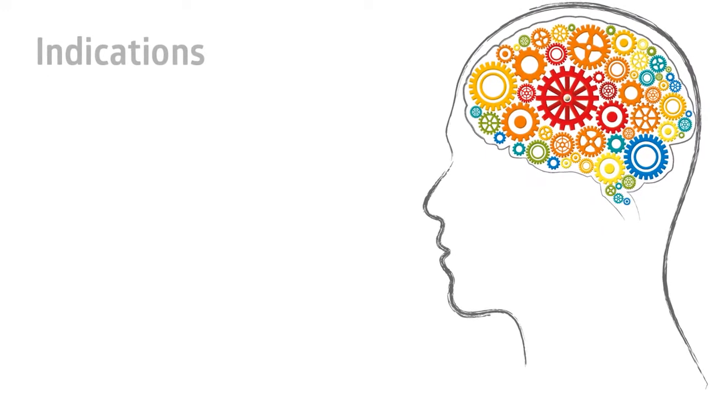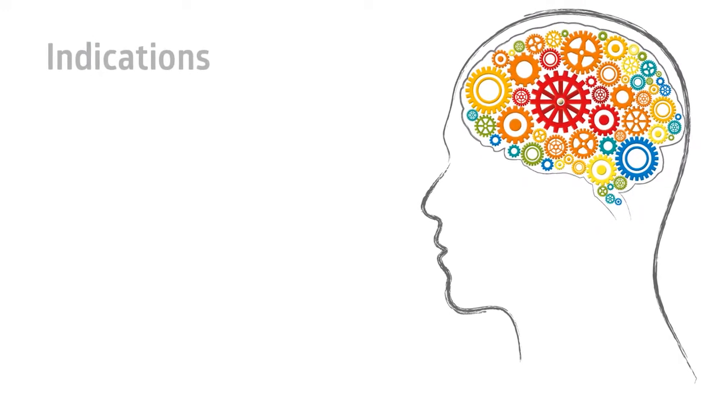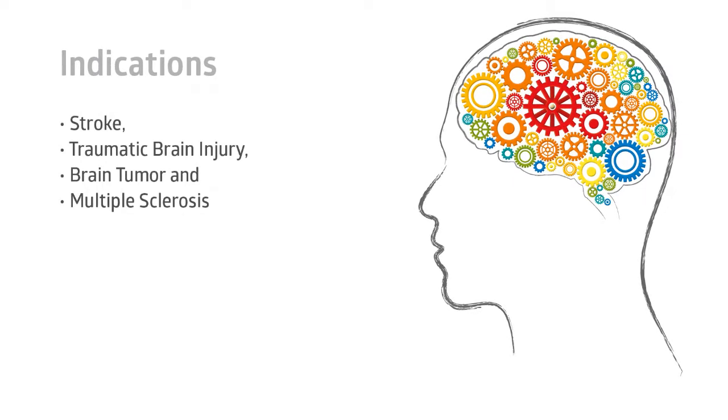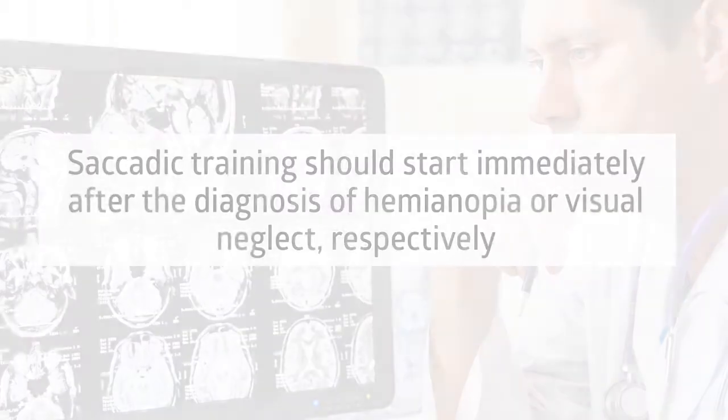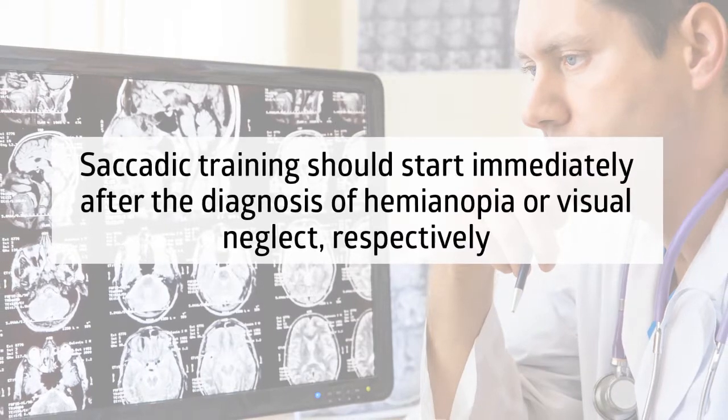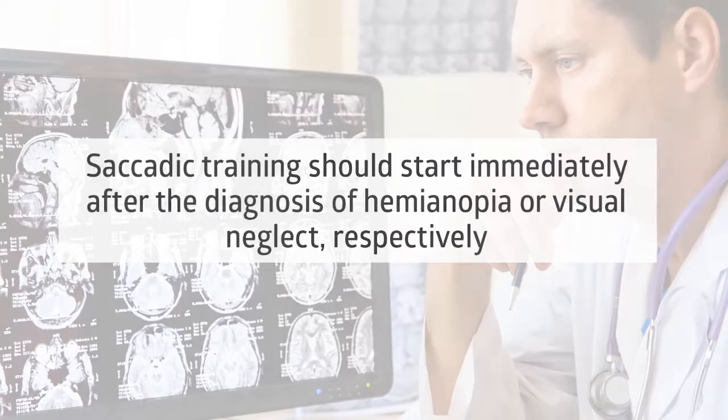The training with this module is indicated for patients with impairments of the visual field or a visual neglect after stroke, traumatic brain injury, brain tumour, and multiple sclerosis. The saccadic training should start immediately after the diagnosis of hemianopia or visual neglect respectively.